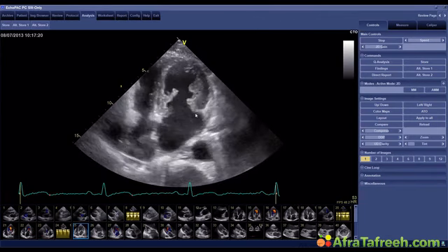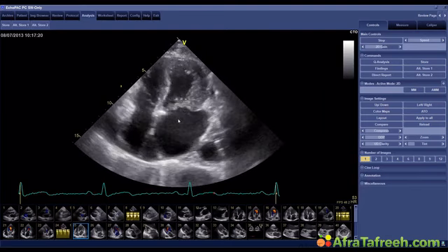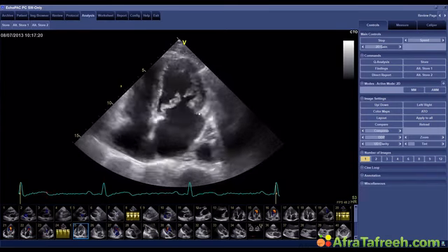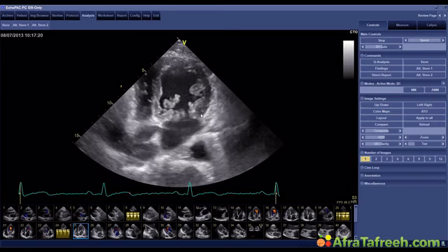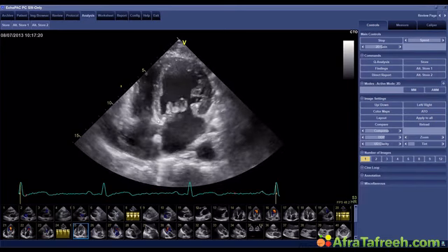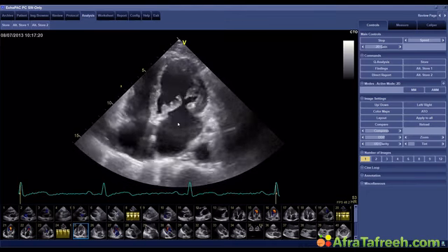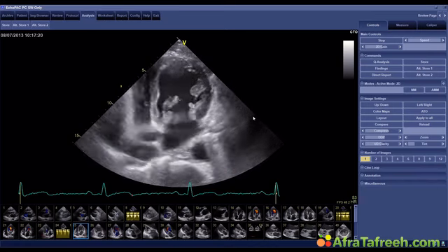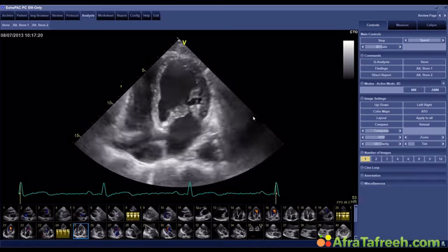It's a typical myxomatous mitral valve, or we also call it classic mitral valve prolapse, where we have redundant tissue, where we have prolapse of material into the left atrium, where we have so-called rocking motion of the annulus. And these patients frequently progress to more and more myxomatous degeneration and to more and more mitral regurgitation. So this is a typical patient where I would say she will have problems in the future if she does not have it right at this time.